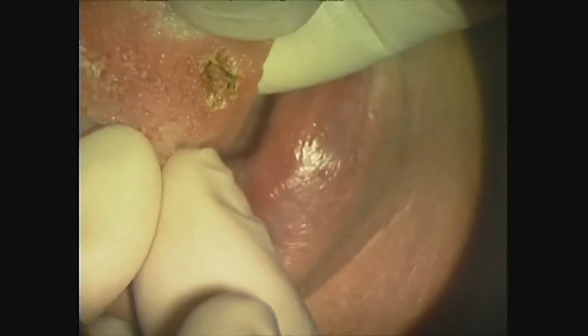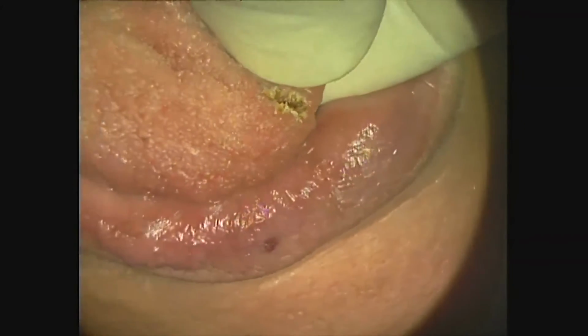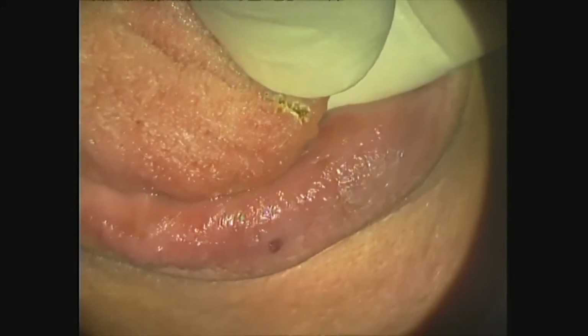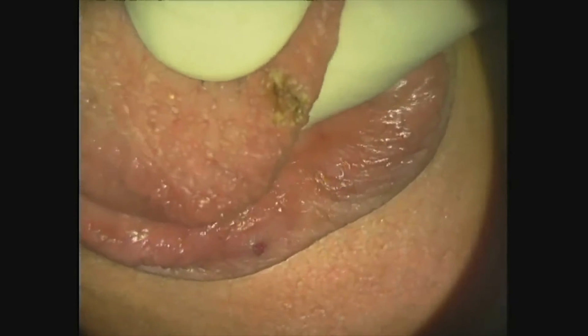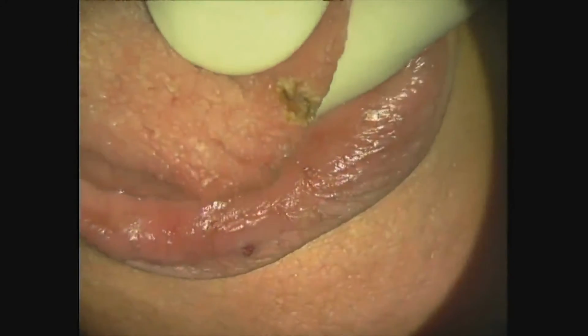Look. Prendi una garza, we put inside the box, mettilo dentro. Ok, great. And una garza, it goes to clean the area. Abbiamo finito, tolto, benissimo. It is very pulito, without any bleeding at all. So, look.